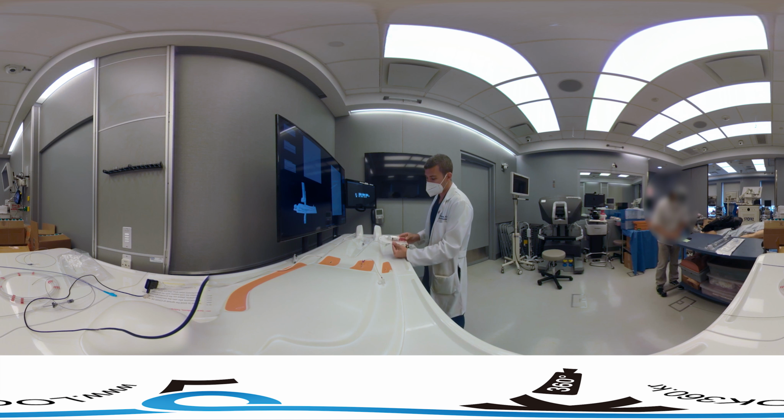So I want to give you a close-up view of the particles that we use for this particular procedure. For the uterine artery embolization, we're using Embospheres somewhere between 500 to 700 micron, and that gives us the right size. Here you can see the small spheres that are suspended. They're like little tiny gelatin balls that are used to fill the artery there. And that gives you a good endpoint for your fibroids.